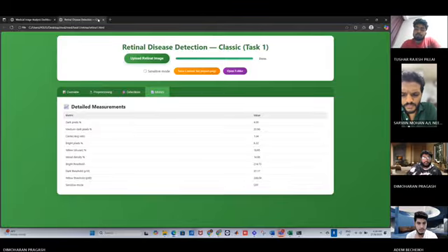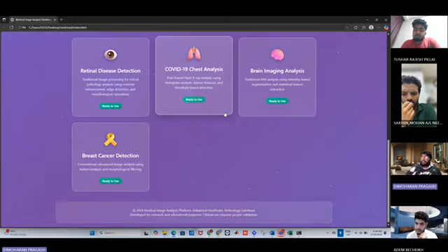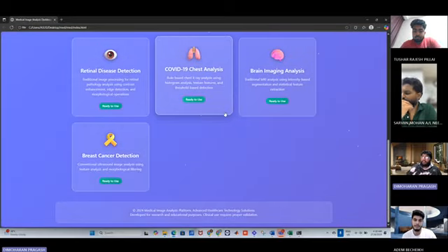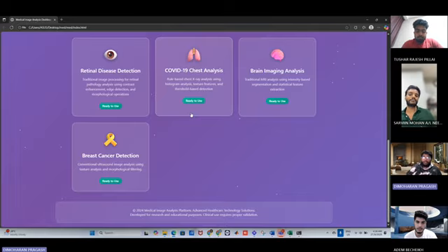Moving onwards, for my task 2, I have upgraded my system to MobileNetV3 Large with multi-label prediction, because patients may have several diseases at once. I use the output with separate thresholds for each disease. To be safe, I require around 70 to 80% confidence for a disease to be positive, and if it's 40%, the image is normal. The service runs on port 5004 and returns the probabilities.